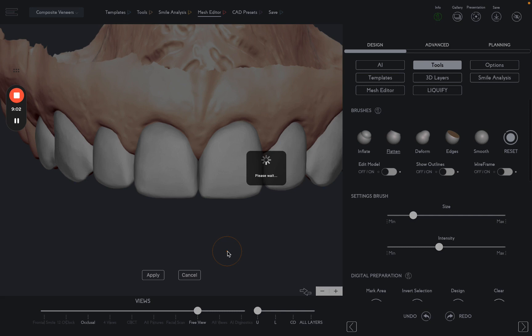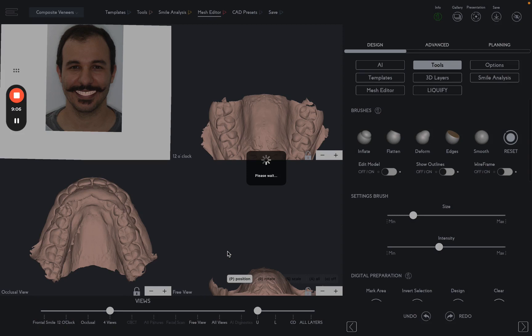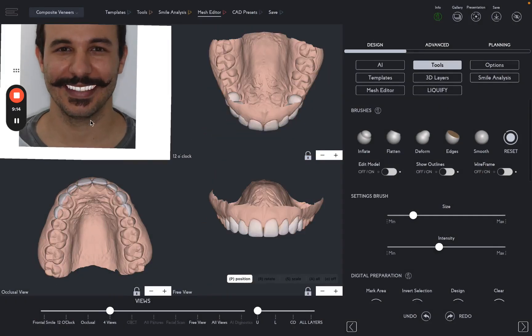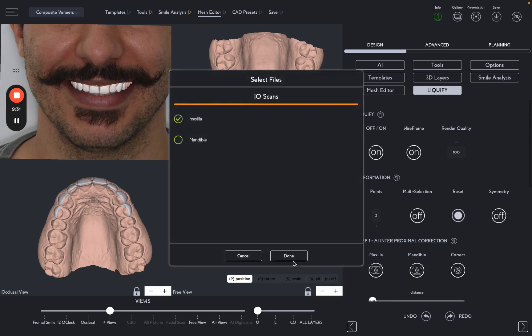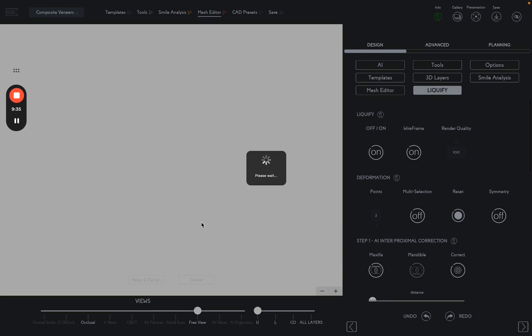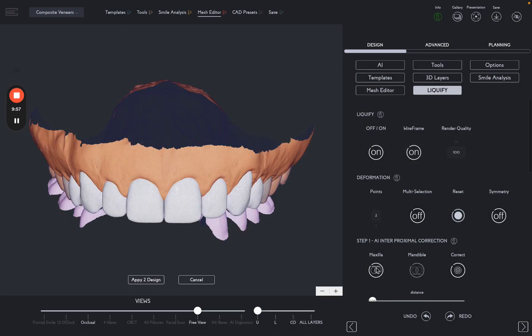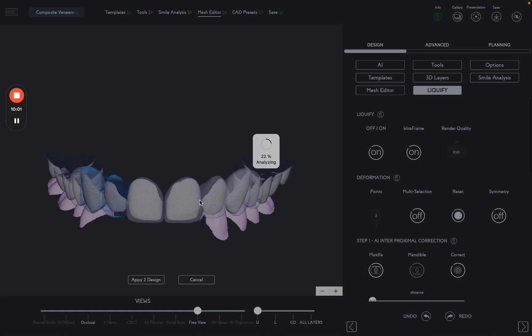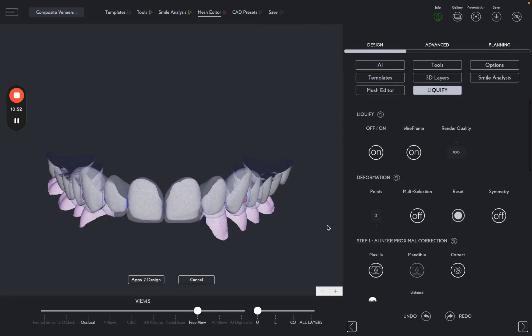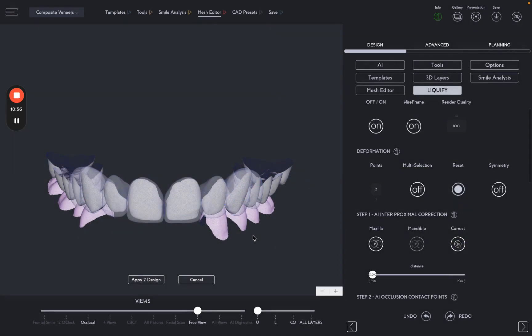The last step is to use the AI to check the interproximal spaces. We let the AI analyze each and every tooth. And with one click, we are going to correct the interproximal spaces. Now let's select Correct and apply the changes.